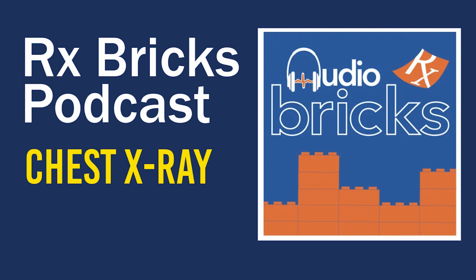Part 1. What is a chest x-ray? The chest x-ray is essential in most pulmonary diagnoses as well as in cardiac and other conditions. It employs radiology, a common diagnostic imaging technique that uses radiation to visualize internal body structures.